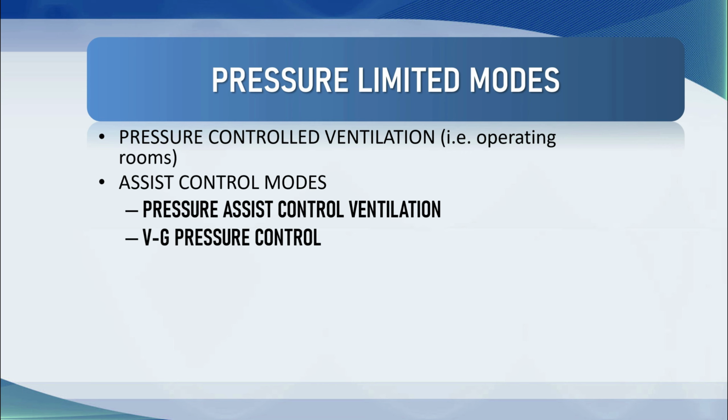And what's important about that is that when the patient takes a breath themselves, the airway pressure is targeted at the limit that you have set, and the duration of the inspiratory time, which is a key component, is always the same.